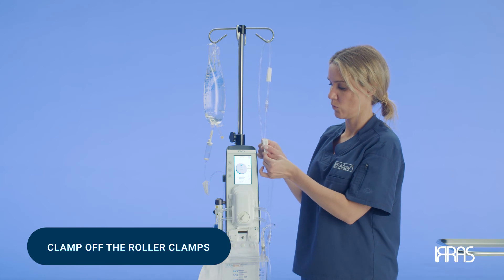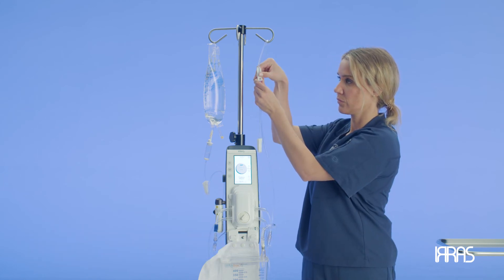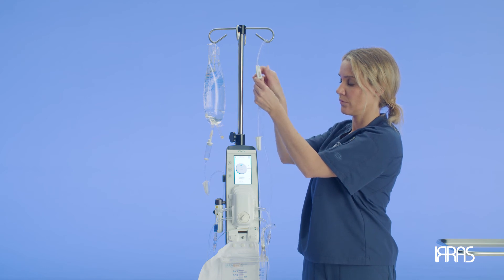Now you need to clamp off the roller clamps on the irrigation and drainage tubing. This will make sure that when you connect the tubing to the catheter, it does not lose its prime.